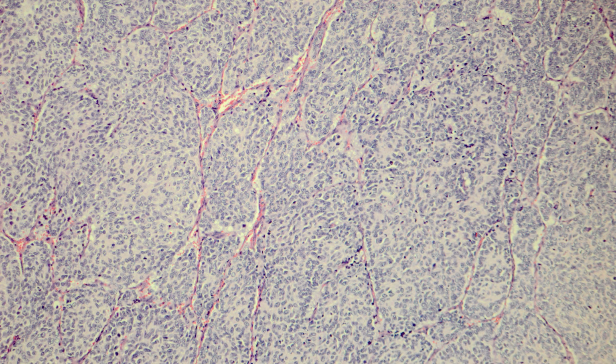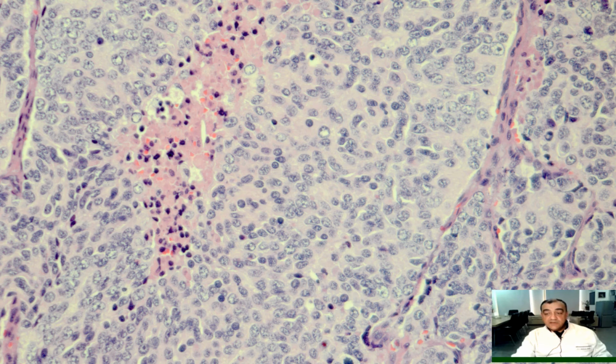that the neuroblastoma is characterized by the development of the so-called neuropils. You can see here a light eosinophilic stromal-looking component, around which we have the neoplastic cells, which gives the characteristic pattern of rosette-like structures. Here under high magnification, you also see some tumor necrosis area, geographic necrosis, which is typical for the neuroblastoma because it's a highly aggressive and malignant tumor.